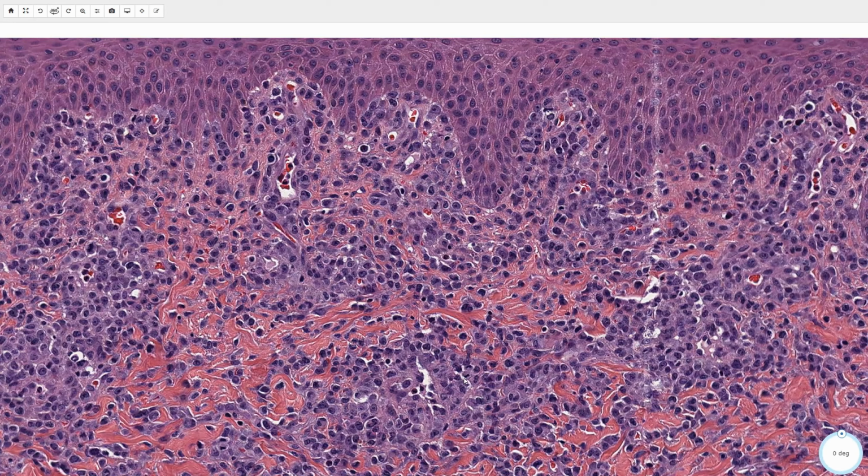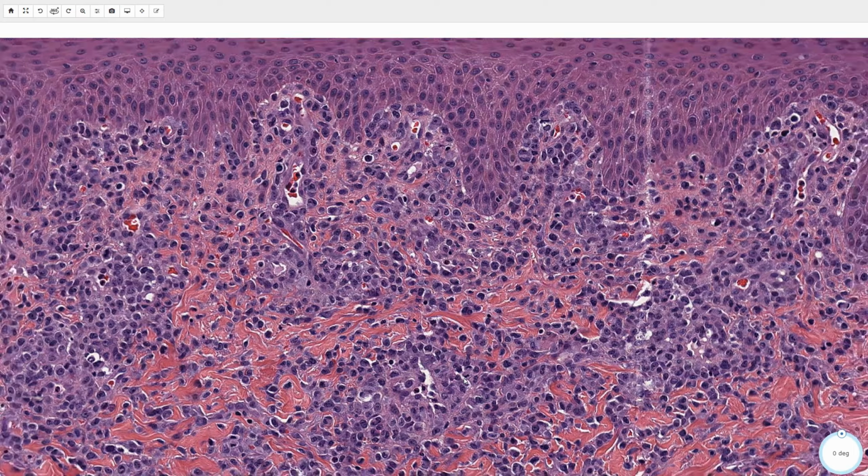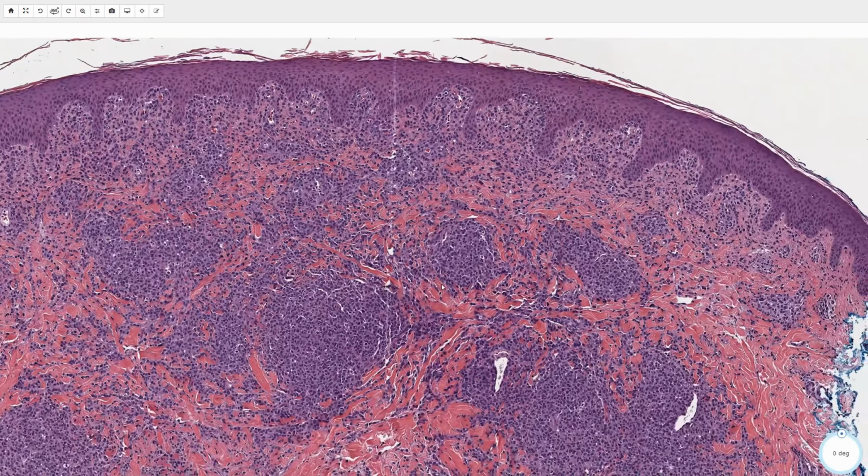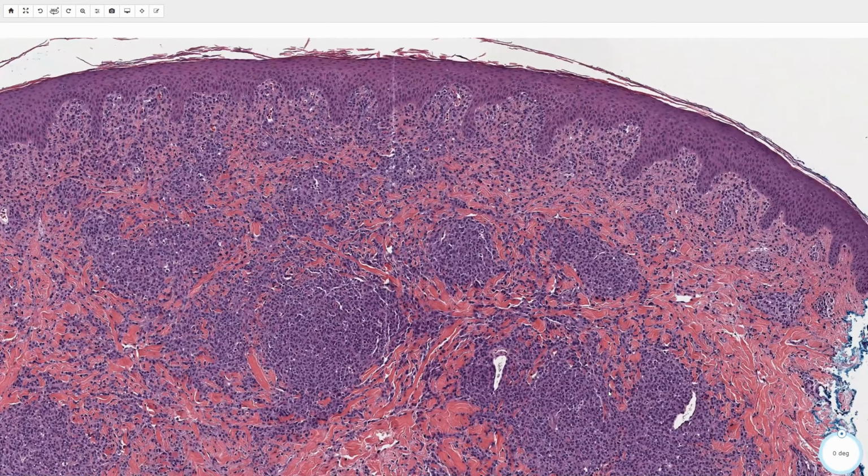These can variably have loss of some markers, and then usually we'll also check ALK1 to see if it's positive or negative to try to determine whether this is a primary or secondary lymphoma. But again, clinical correlation here is often necessary to distinguish those two. And in this case, it's important to distinguish that more than 75% of the cells should be CD30 positive.